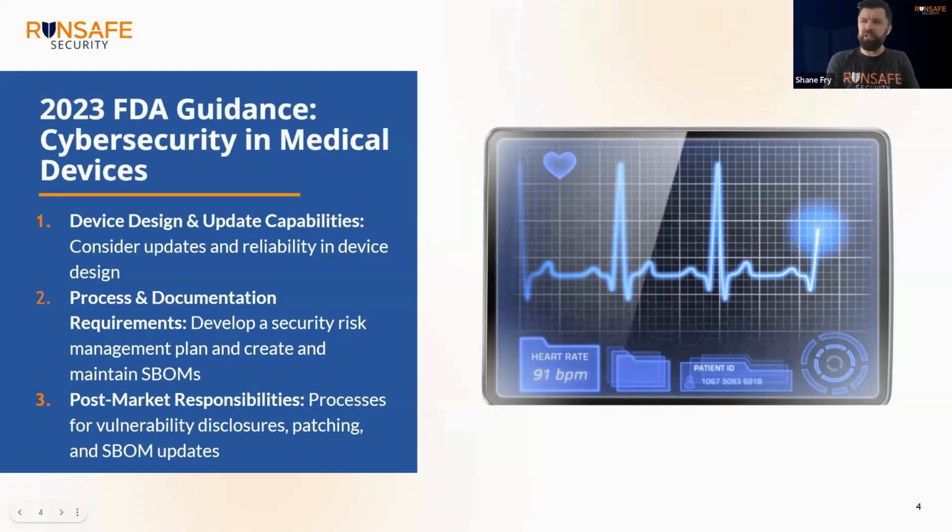Yeah, there's a lot of challenges. You almost don't even know where to begin, to be honest. As you tailored that towards the post-market side of things, it's definitely a concern. There's a lot of vulnerabilities that aren't discovered until after you've shipped software, and that's the unfortunate reality of the world today. So there's got to be this SDLC on the development side as we shift left and do more testing and scanning and preventative measures going left. But when you think about the whole life cycle of a medical device, whether that's a pacemaker or a patient monitor or CT scanner or something like that, how often are those devices getting updates?